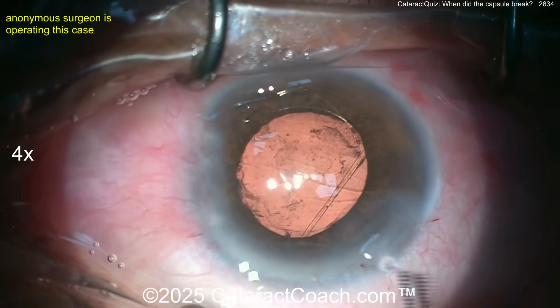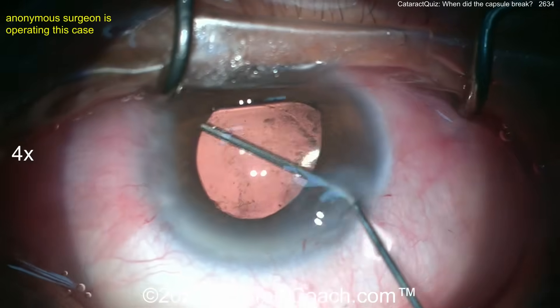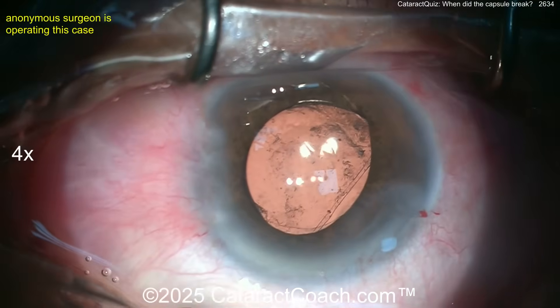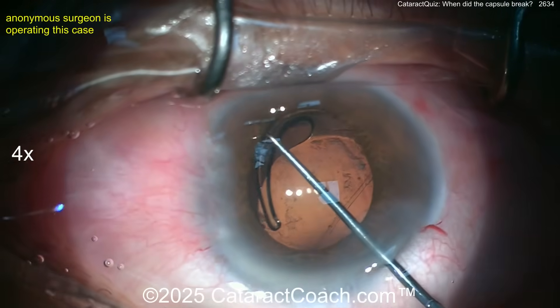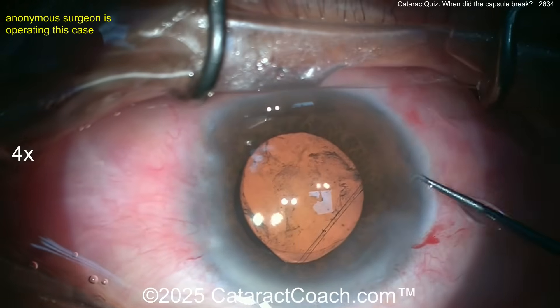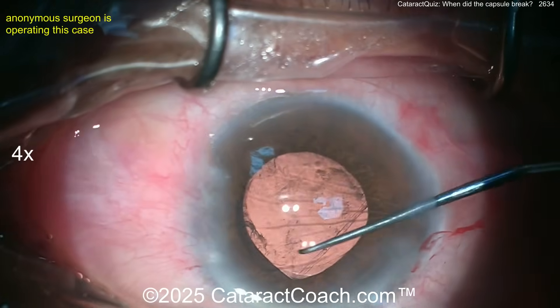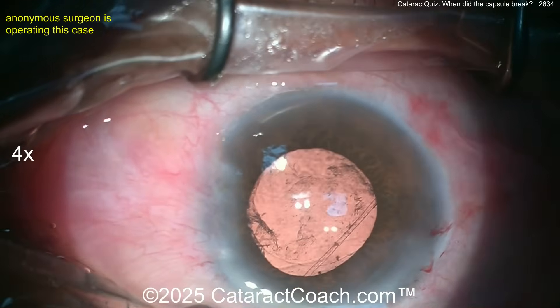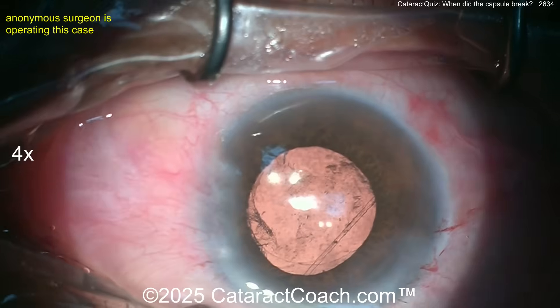One haptic is still out — get that tucked in. This is a little tougher now because more maneuvering risks damaging the bag further. Get a Sinskey hook — pull that haptic toward you. Make sure it's all in the bag. Surprisingly it looks pretty stable now. I may have chosen a three-piece lens with haptics in the sulcus instead — that's more in my comfort zone — but this certainly looks like it worked out.